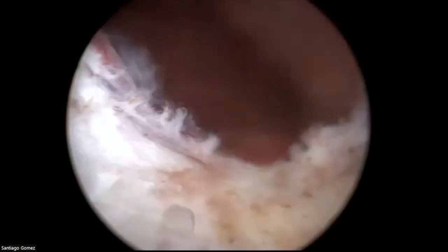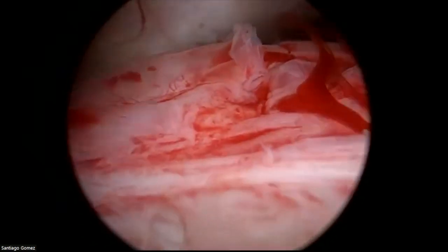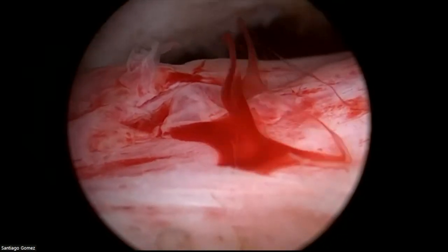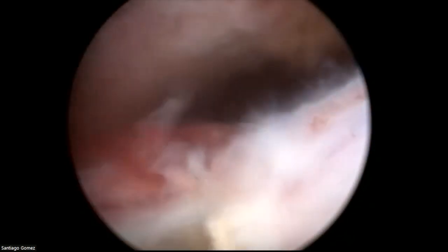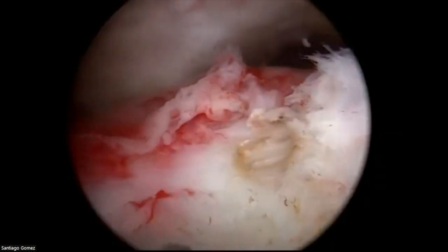So I spend a little bit of time trying to coagulate these vessels. Here there's some near the mucosa, but of course we are very close to the UO. So we have to check where we are and very carefully control these bleeders without interfering with it. There we are.